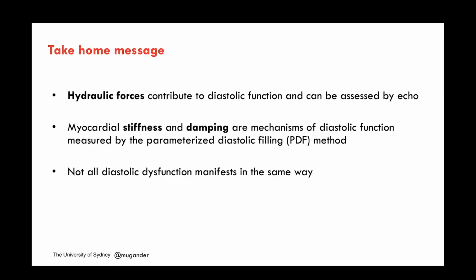In summary, we've talked about initially hydraulic forces that contribute to diastolic function and can be assessed by echo through the atrioventricular area difference. It's just based on the geometry, the differences between the left atrium and the left ventricle, but there's a connection to the physics in there. And then we have myocardial stiffness and damping that are two opposed mechanisms contributing to filling. The stiffness is driving the filling, and the damping is opposing the filling, which we can measure simply by measuring acceleration time, deceleration time, and peak velocity of the E wave.